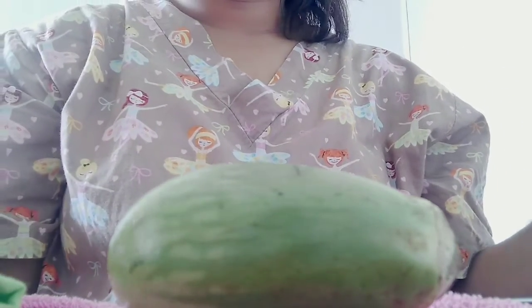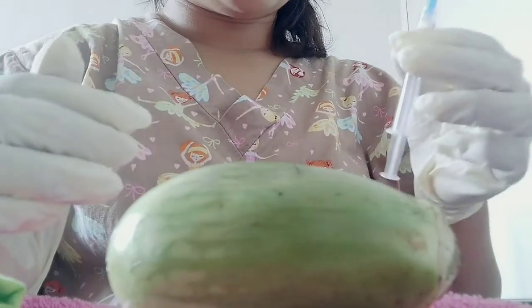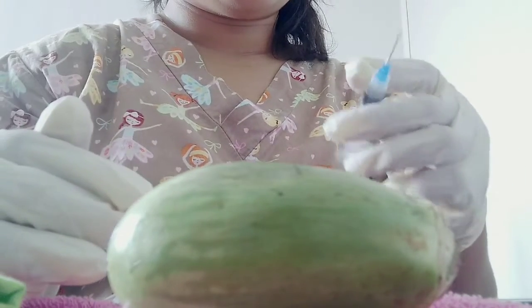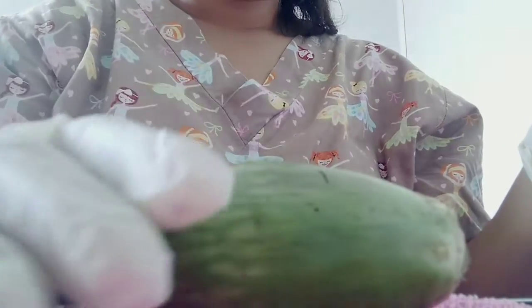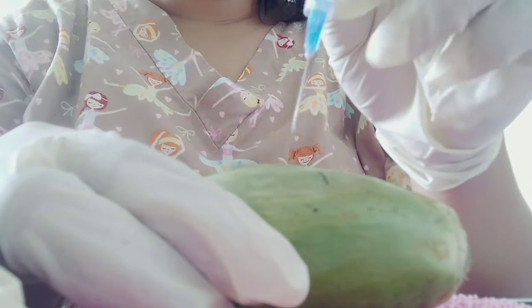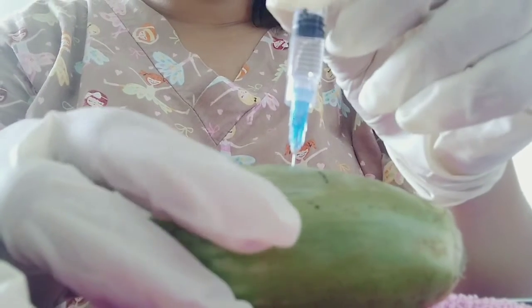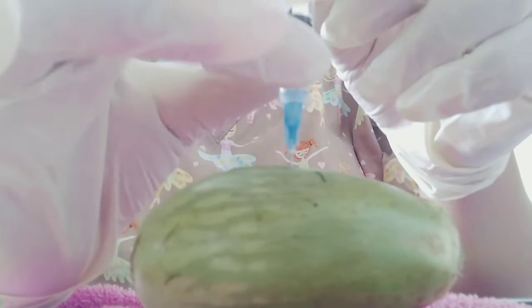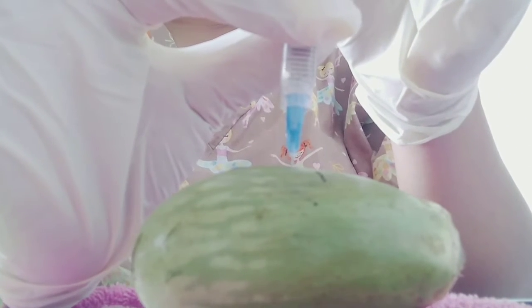Then we are going to uncap the syringe and hold the syringe using a thumb and a forefinger as if you are holding a dart. Then you are going to insert the needle at a 90-degree angle. Then you are going to aspirate by pulling the plunger.